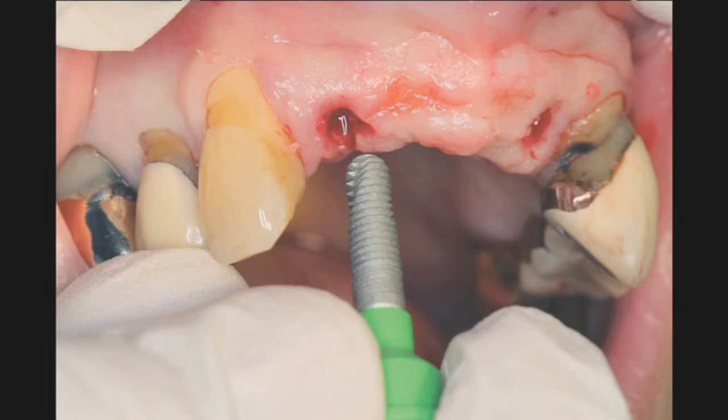So you can see these are self-threading implants, and we are undersizing the osteotomy site. The site that we created is actually slightly smaller than the diameter of the final implant. So this gives us outstanding initial implant stability.